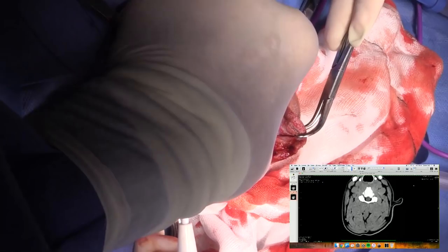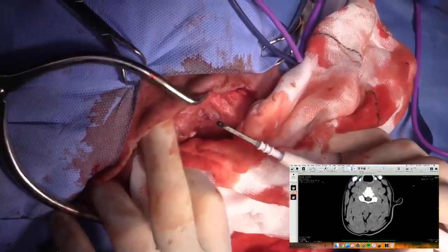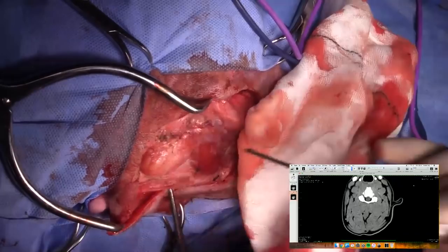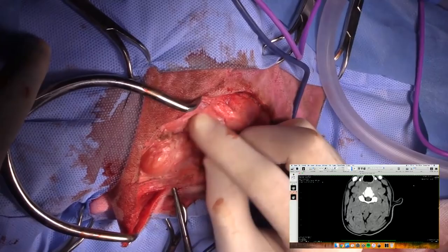All right, so that's out, and I'm just going to review my anatomy here. So that's the masseter muscle sitting up there over the ramus of the mandible. I can palpate my temporomandibular joint up here. That's the mandibular salivary gland. The digastricus muscle is going to be sitting right in here, and that's what we have to pass the salivary gland over in order to get to the sublingual region, which is down here. The wing of the atlas is sitting there again. Maxillary vein, lingofacial vein, jugular vein back here.